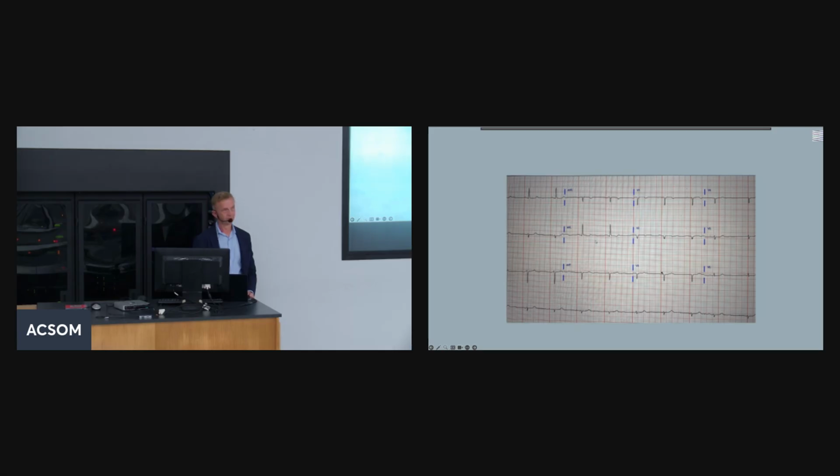Do you see anything else? There is no transition, or there is a late transition from the negative to the positive in the QRS complex, which should be between leads V3 and V4. So these are all Q waves.